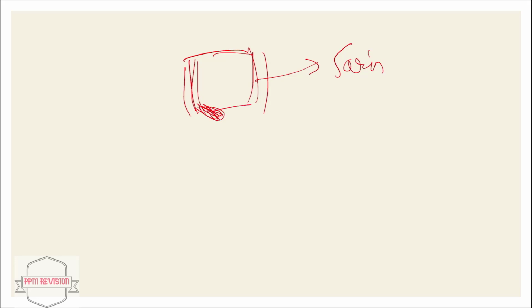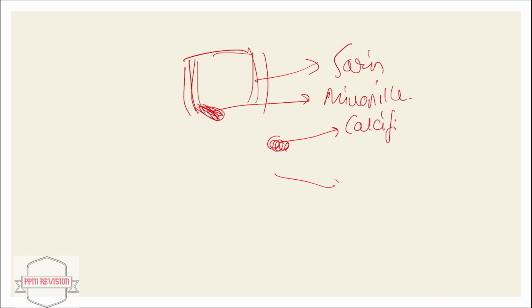Just drawing it again: scarring, presence of micropapillae, calcification, hemorrhage, and chronic inflammation.